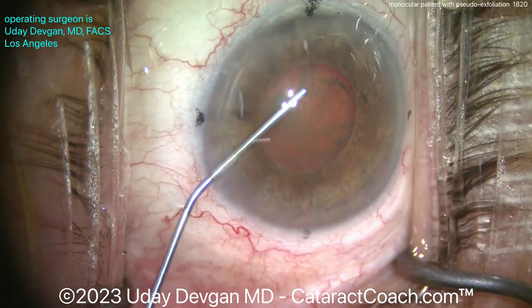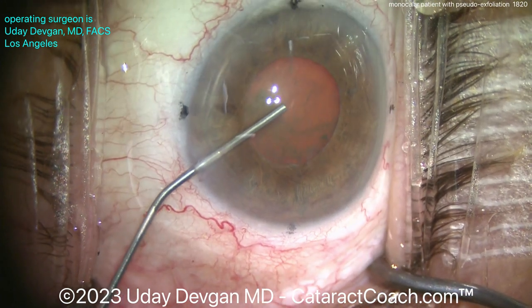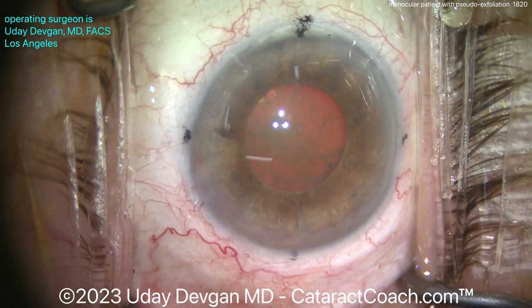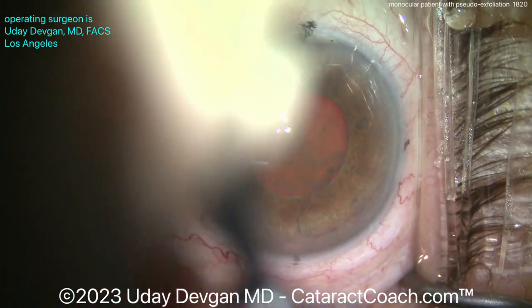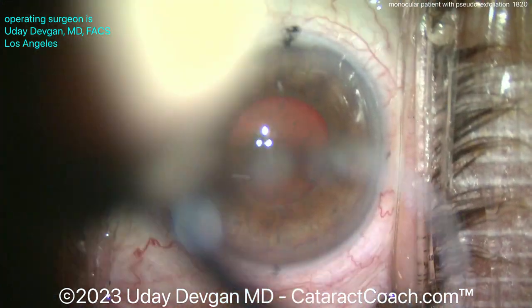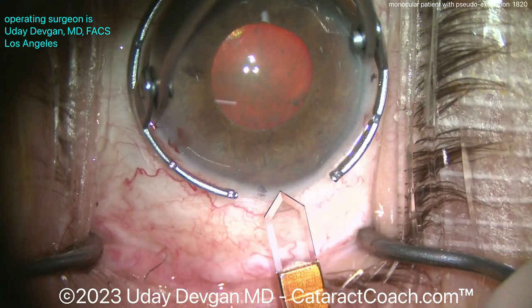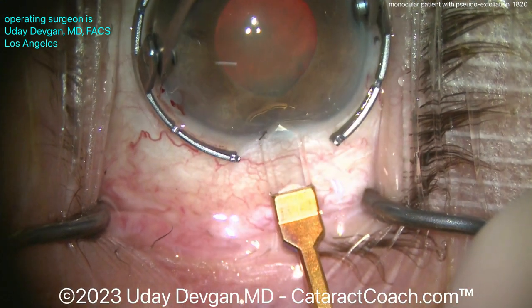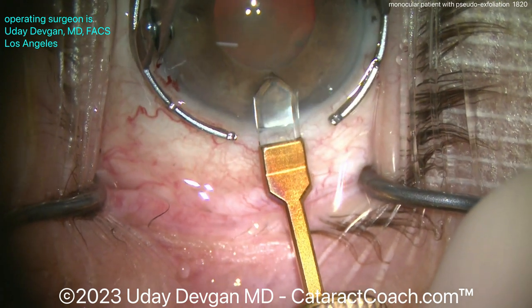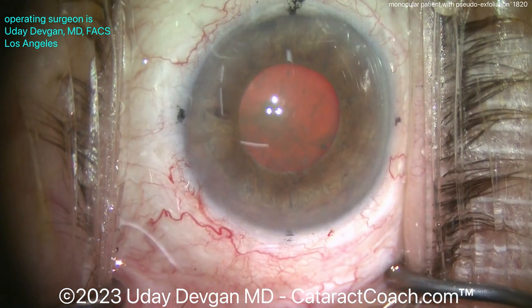Doing a little bit of viscomydriasis here with our dispersive viscoelastic, just trying to get the pupil a little bit bigger. Notice I don't do a big fill — maybe about 75% fill — because I'm going to put in more viscoelastic as I continue the viscomydriasis. We'll make our main incision here using a diamond keratome, 2.2 millimeters wide, on the steep meridian at the 11-degree axis. There it is, slightly enlarging that to make a nice easy fit.